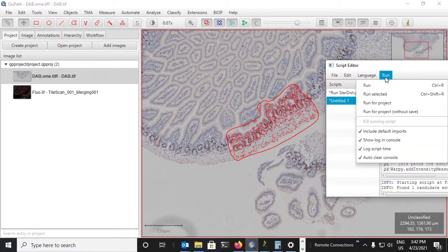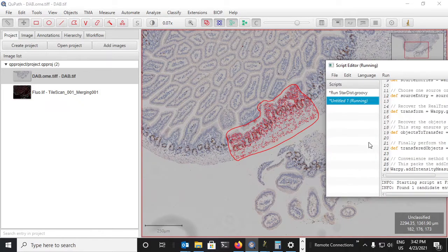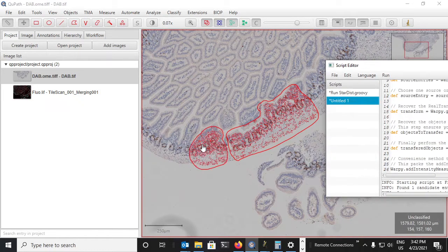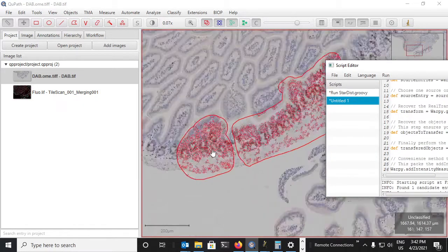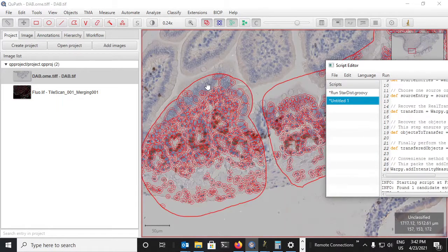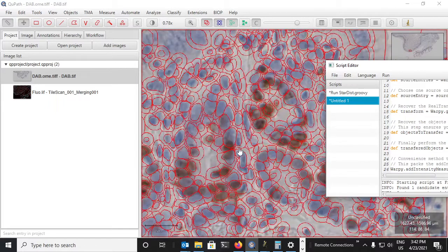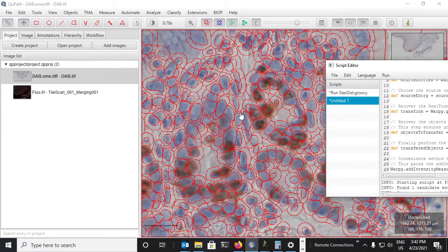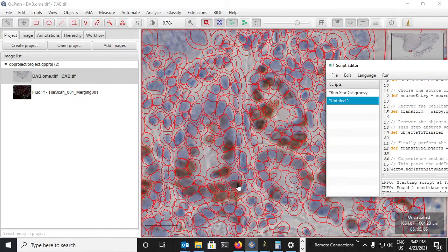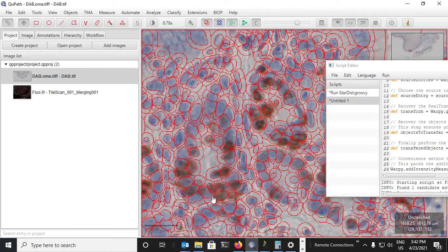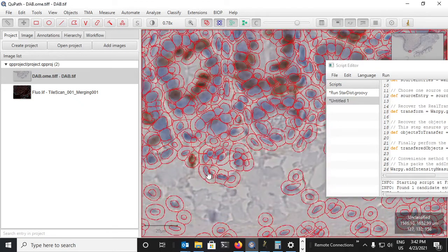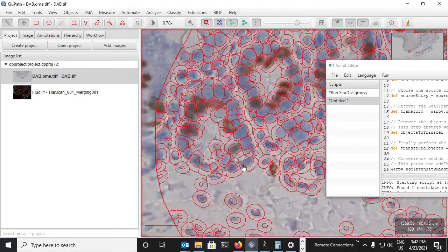And now on the DAB image I will run exactly the same script. There's nothing else to do. And we see now that these annotations have been found and have been transferred correctly and we get a really nice cellular level resolution if our registration was done correctly.